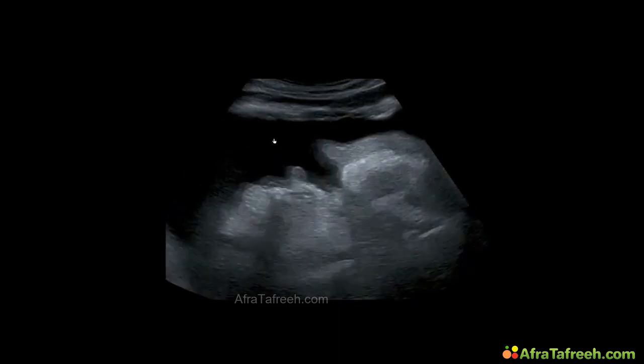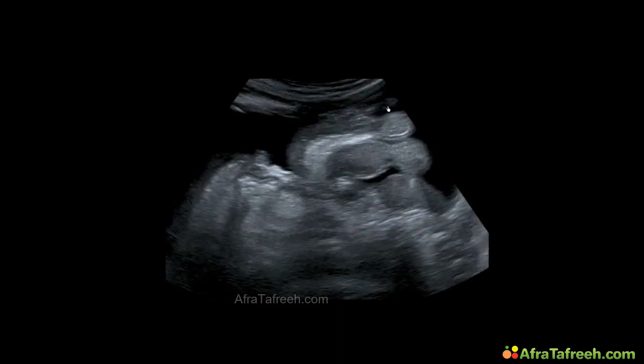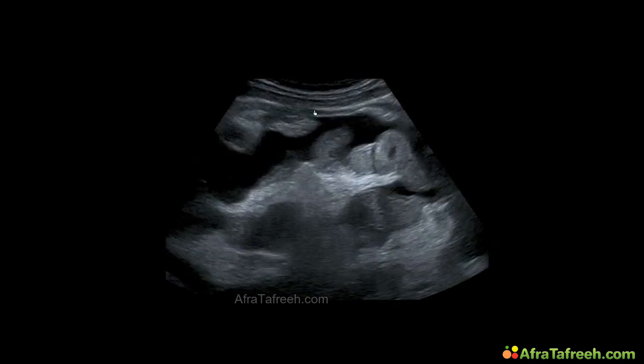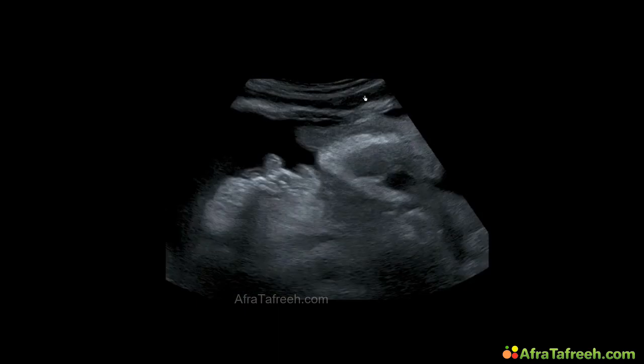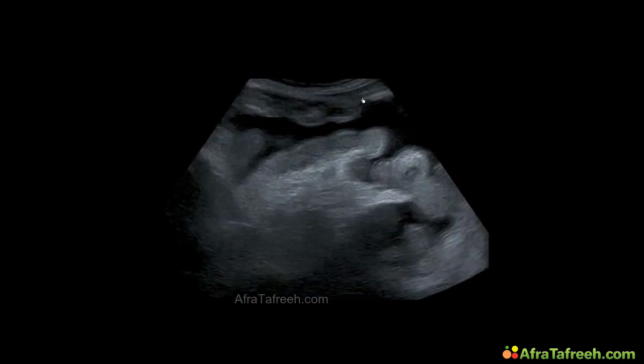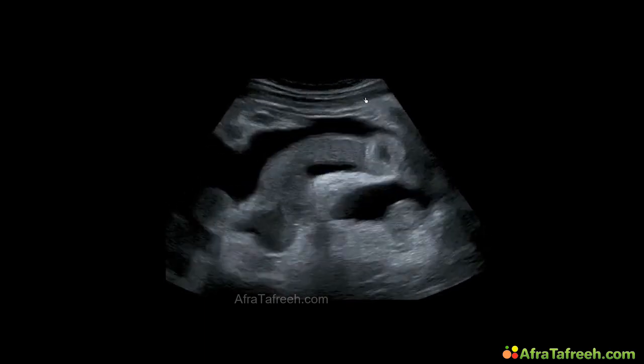And when you take a closer look at the abdominal wall of the patient, we see that there is a solid tissue directly connected to the abdominal wall, so we can detect metastasis inside the peritoneum. In this area of the peritoneum, there are metastases of an ovarian cancer.